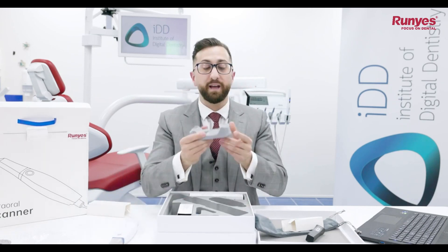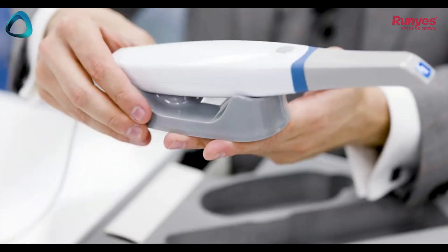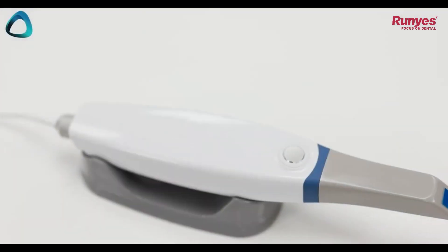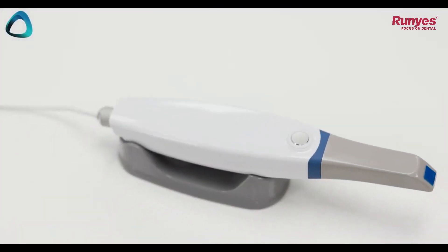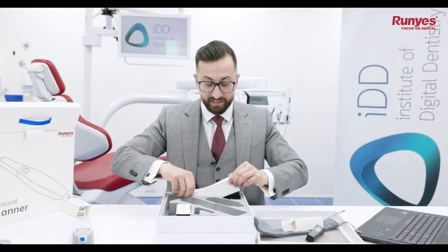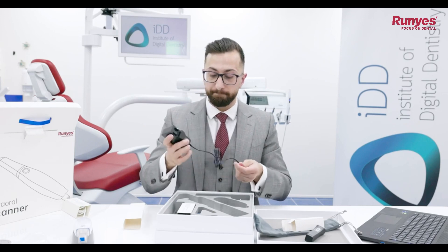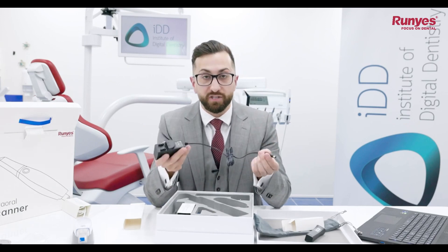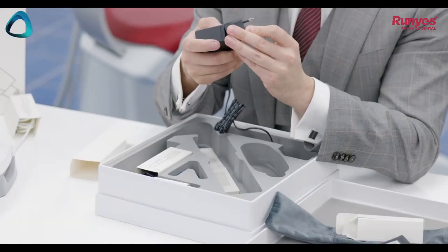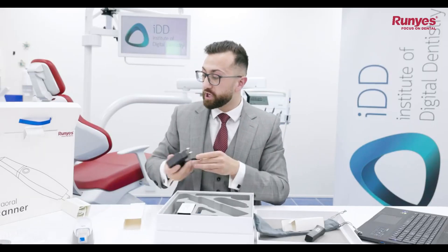We also have a scanner base, which is very common in the market nowadays — you can see the scanner sitting there on your desk or cart. The last item in the box is a charger, again very common in the market. It comes with an adapter and is just your standard wall charger.